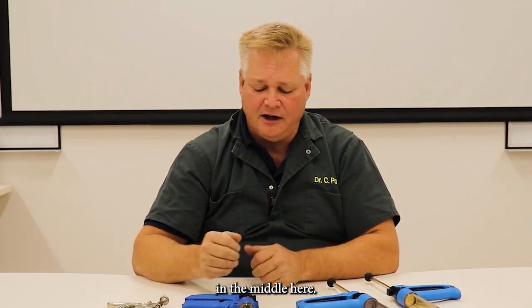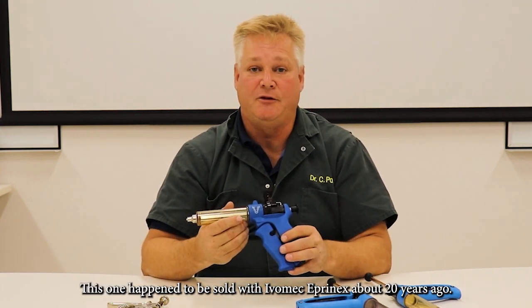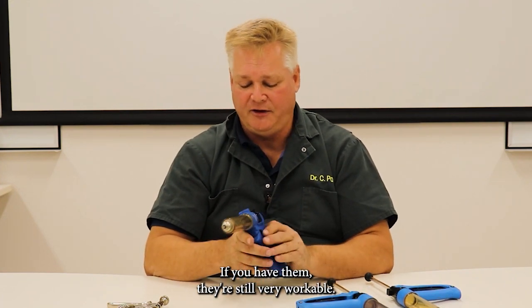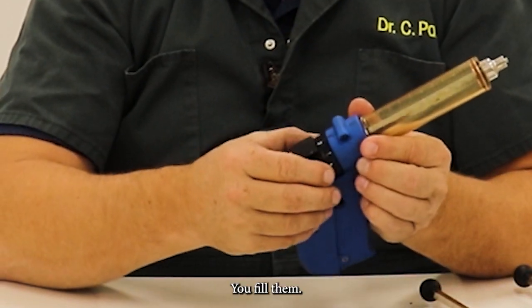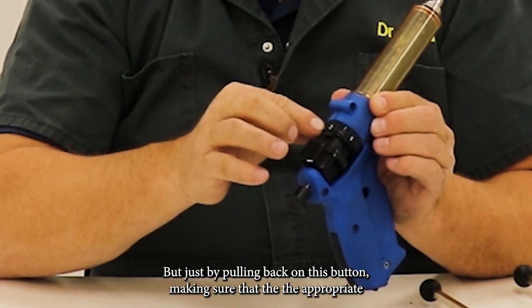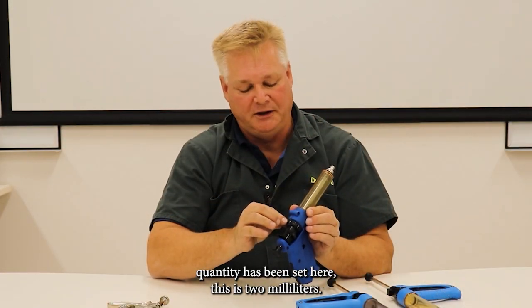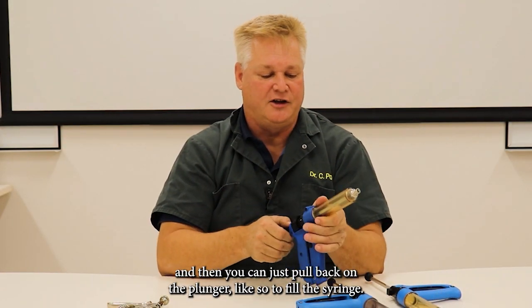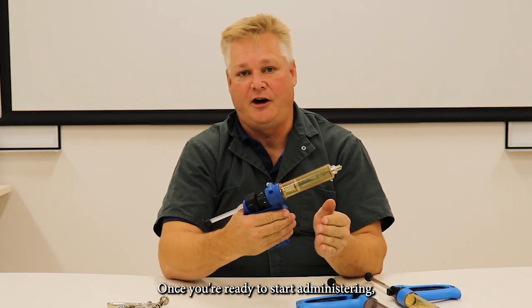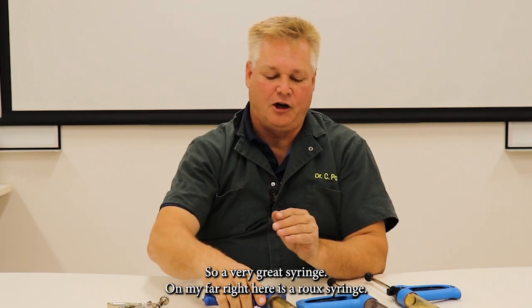In the middle here, we have an older variety of syringe. This one happened to be sold with Ivomec Eprinex about 20 years ago. It's a great syringe if you have them — they're still very workable. You fill them just by pulling back on this button, making sure that the appropriate quantity has been set here. This is two milliliters — there's the arrow — and then you can just pull back on the plunger to fill the syringe. Once you're ready to start administering, just squeeze the handle and it locks into place. It's a very great syringe.